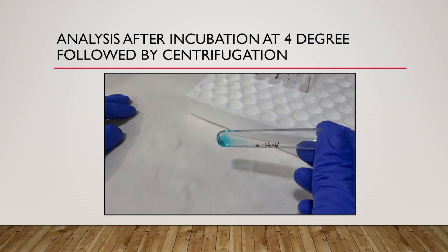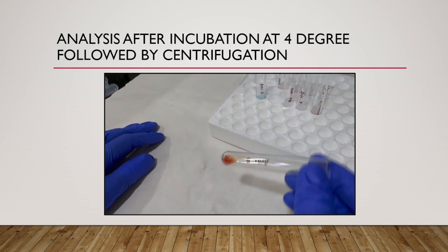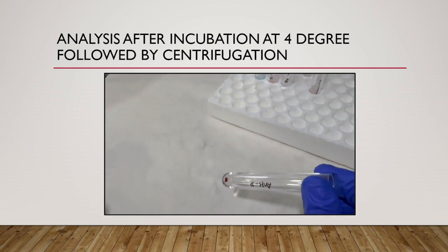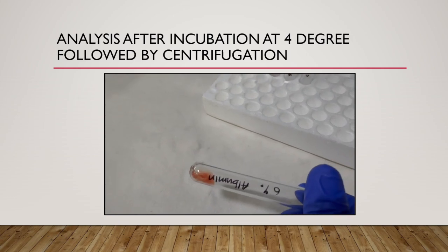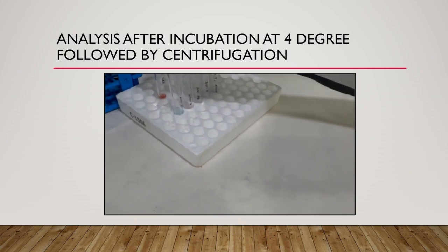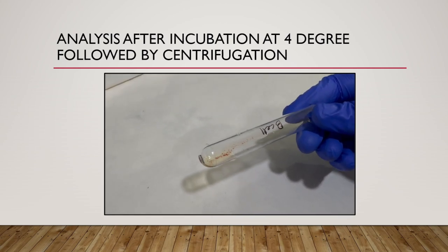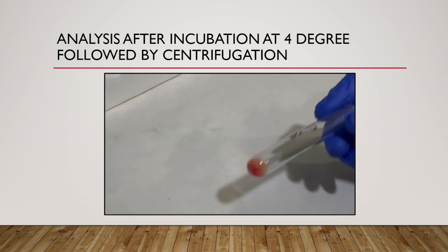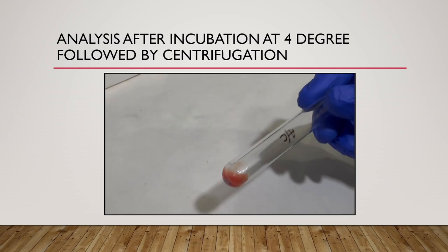We can see that first proceeding with the forward grouping tubes, there is a strong 4 plus reaction in anti-A. There is no reaction in anti-B. In anti-AB also there is a strong 4 plus agglutination. Anti-D also there is a strong 4 plus reaction. In the control tube of 6% albumin there is no reaction. Coming to reverse grouping, there is no reaction in A cell. In B cell, after gently shaking, we can see that a 1 plus agglutination reaction has developed, which was not initially there at room temperature. Coming to O cell, there is no agglutination, and there is no agglutination in autocontrol tube also.